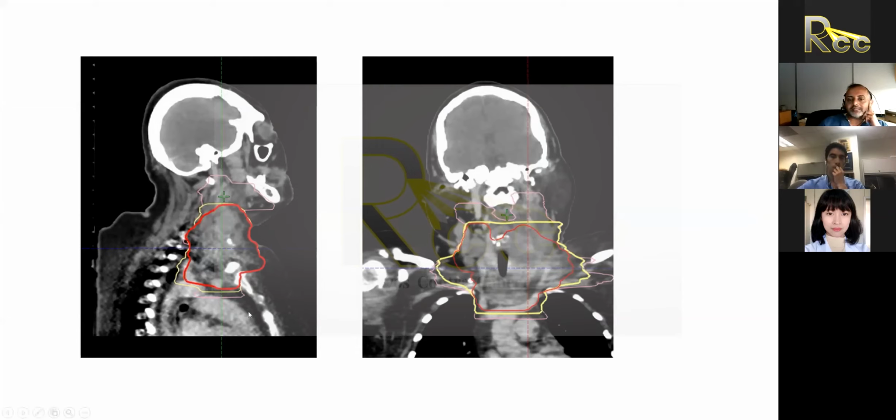But you can get a sense of these. Generally, when you're treating these thyroid cancer patients, you're not only treating the neck, but you're almost always treating that superior mediastinum in these patients. And the elective decision you come to is how much of the upper neck you're going to irradiate in a patient. Any questions about thyroid cancer?